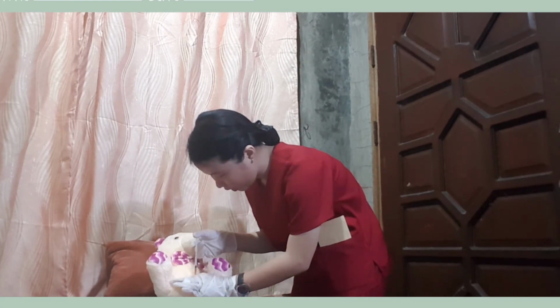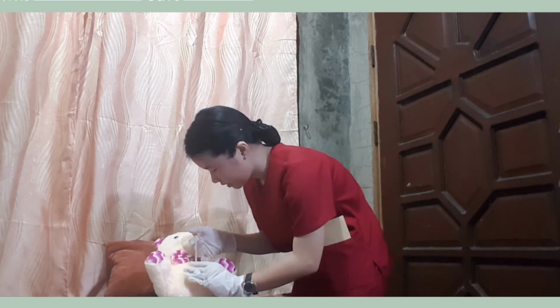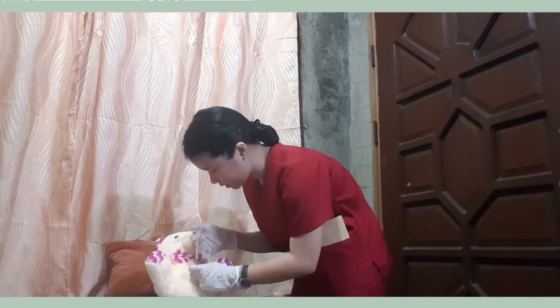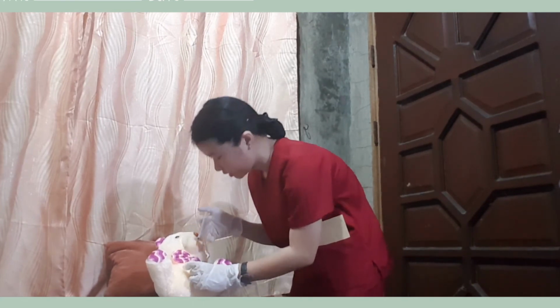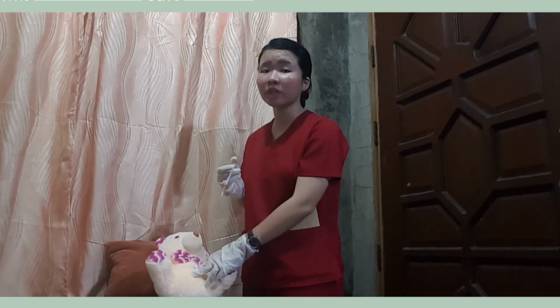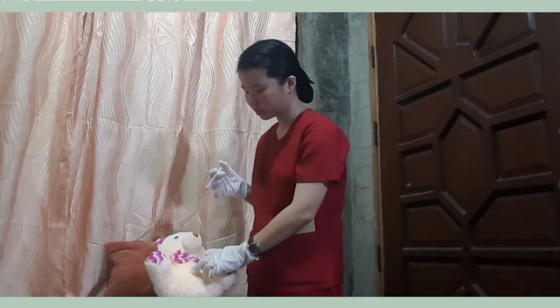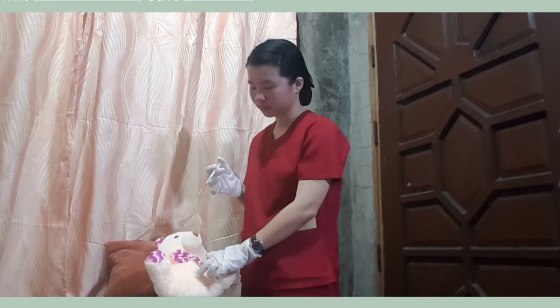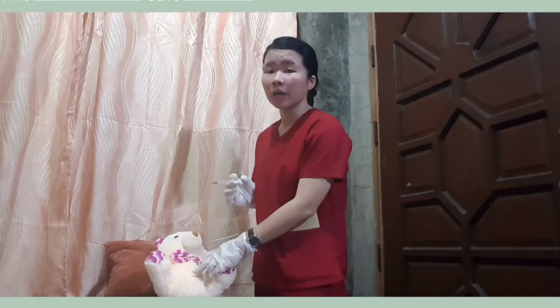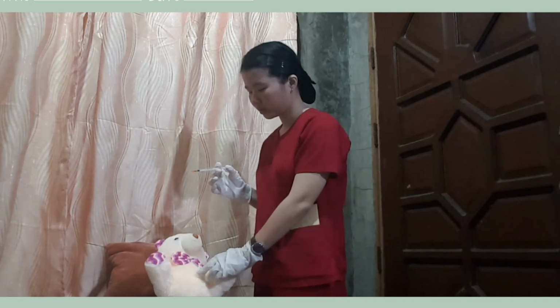One, two, 3, 4, 5, 6, 7, 8, 9, 10. And after that, you need to use the cotton from the non-dominant hand to gently swab the area. Do not massage. This is because massaging can force the medication to diffuse to the surrounding tissue.